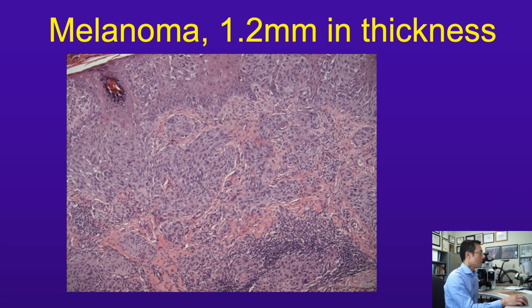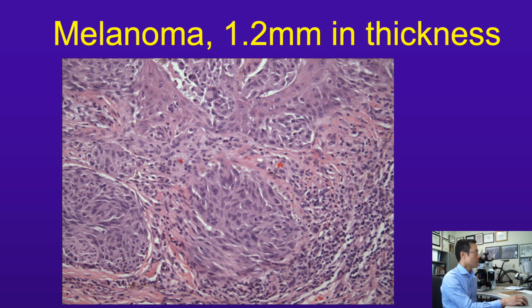Looking at the underlying dermis, we can see irregular nests of atypical melanocytes. There's no apparent maturation or diminishment in nest size or melanocyte size with descent into the deep dermis. In this particular nest, there is a mitotic figure visible. Also note the relatively dense lymphocytic host response surrounding the tumor. Lymphocytes, mitosis, which we'll look at closer.